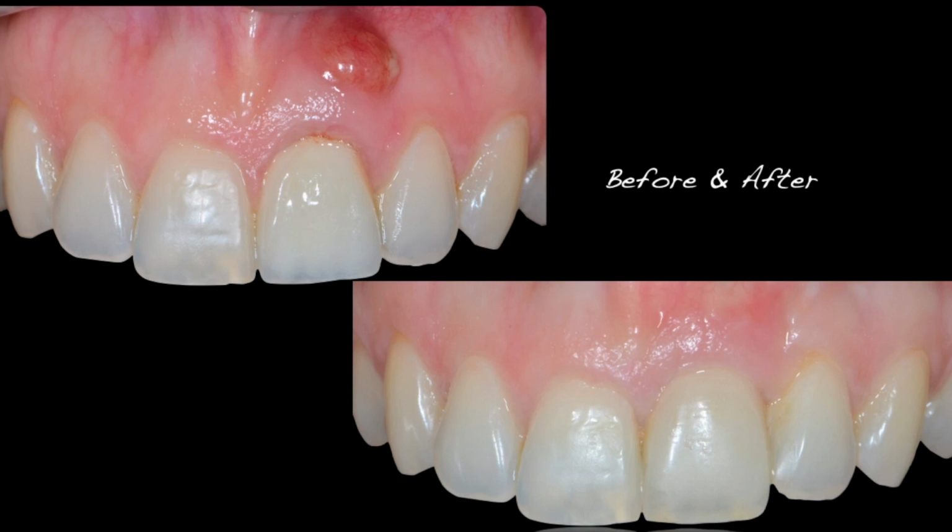And finally, this is just a look at before and after. The patient came in with a huge acute infection. It was a very challenging case, but the fact of properly diagnosing the case, properly staging the procedures, and of course knowing how to set each stage at the perfect tone, where we first built up the bone with some xenograft and then allowed for proper maturation of tissues, and then pushed the tissues buccally to recreate a proper contour.